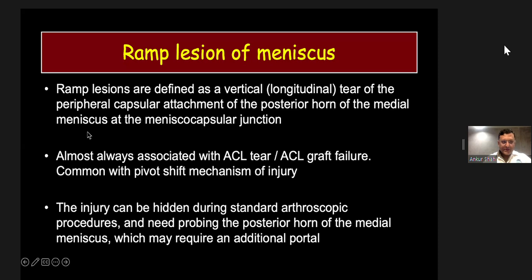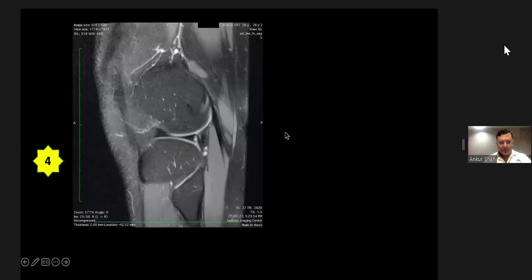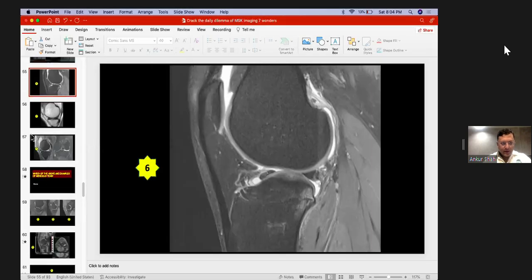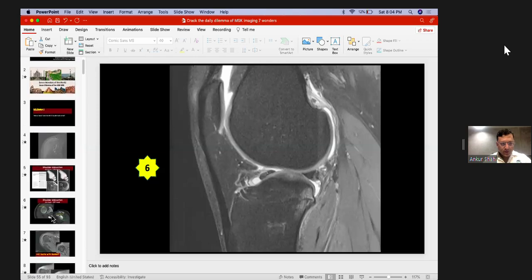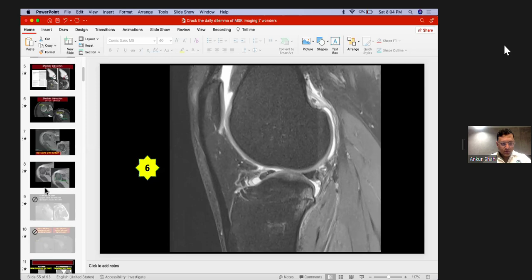With such lesion percentage, that circle is just the best fitting circle. I think it will again be difficult to go back and show those circles, but you can easily find that in multiple articles. They nicely explain the concept of those circles and how to measure them and all those angles.